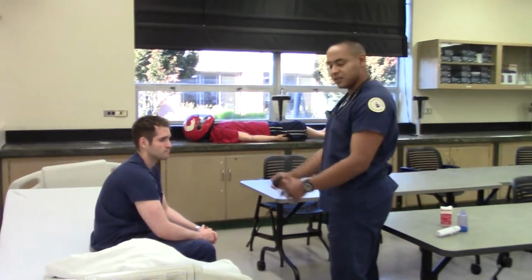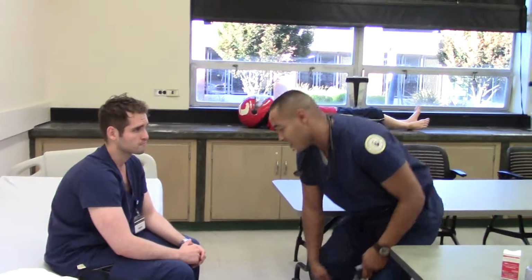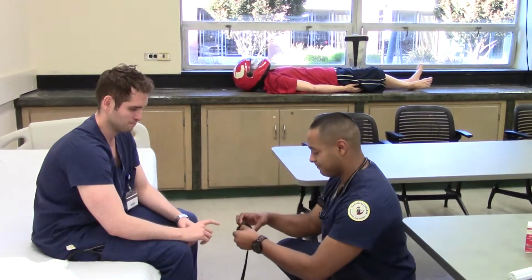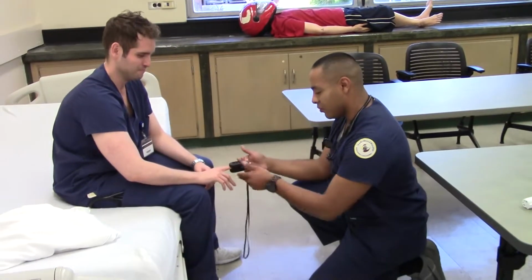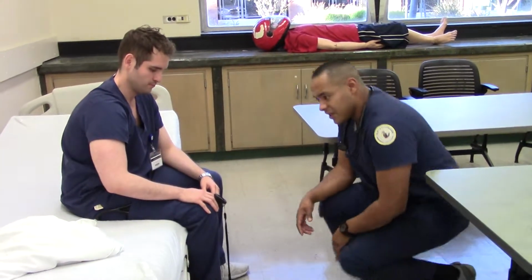Okay, he's sitting down on the bed. He probably wasn't getting up before I got in the room, but it looks like he can get up. Anyways, talk too much. There we go, pulse ox. Let's get this on your finger. I'm going to check his lungs.